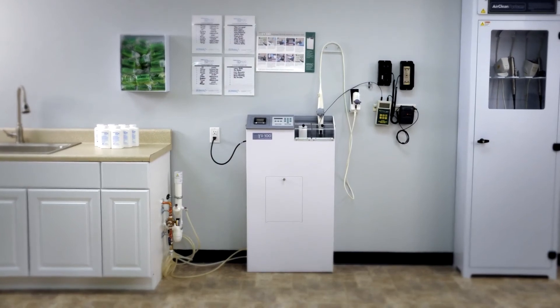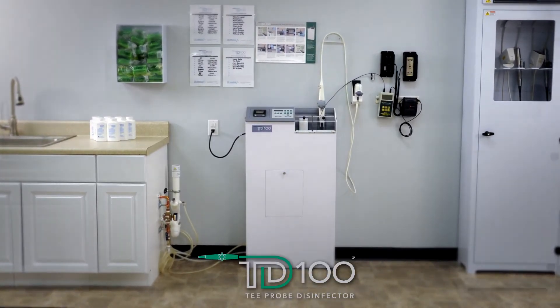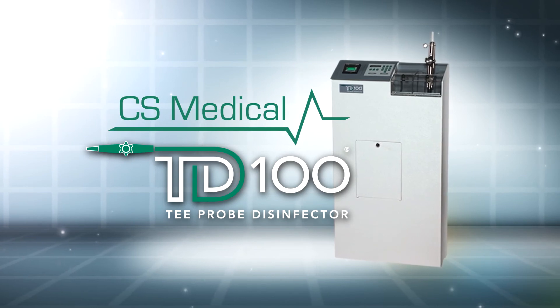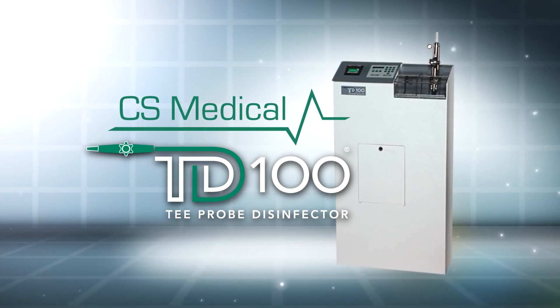The TD100 automated transesophageal probe disinfector allows you to disinfect delicate TEE probes with the confidence that each and every TEE probe will receive the same validated disinfection process. CS Medical would like to thank you for your time in considering the TD100 automated TEE probe disinfector for your hospital.